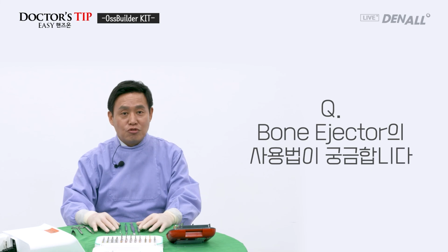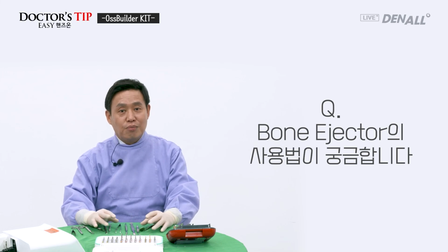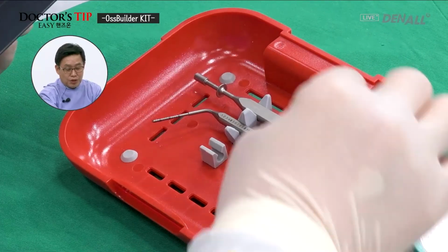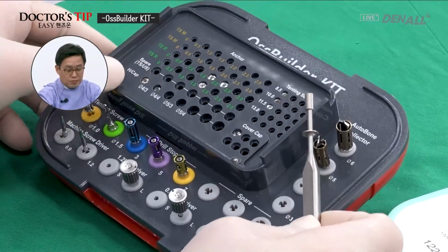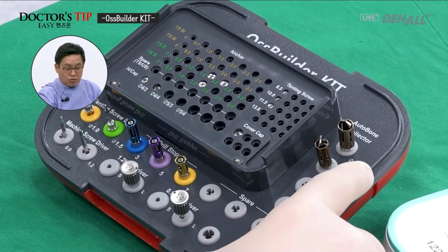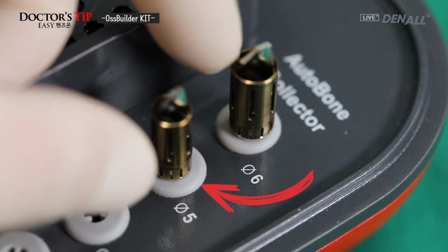Next question. I am curious about how I use bone ejector in the autobone collector. In the previous lecture, I talked about using autobone collector and doing bone ejector. I forgot. I'm going to show you briefly. So if you look at the OssBuilder kit on the bottom, you can see the ejector. On OssBuilder kit, autobone collector, there's 2 diameters, 5 millimeters, 6 millimeters, and using 5 millimeter autobone collector, I'm going to harvest.